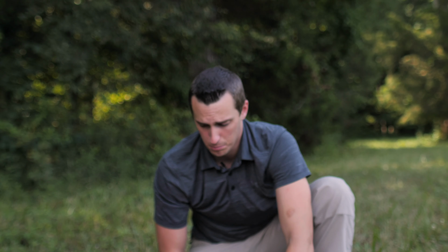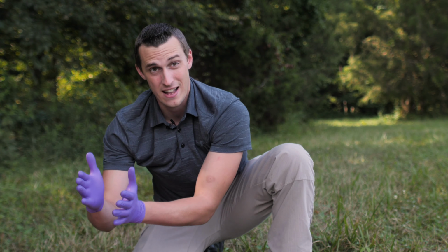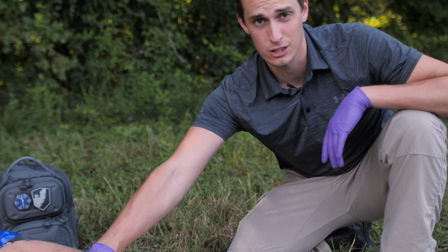If it does, we may need to apply more pressure, and if needed, I can quickly go and just retighten this tourniquet. That stops the blood flow so that we don't end up losing more of the precious blood in this person's body. So we've done the wound packing. We have this injury taken care of. We still have the tourniquet in place, but it's loose.